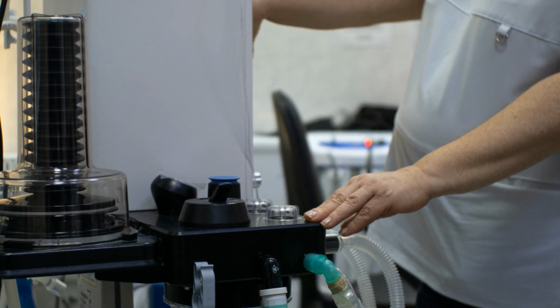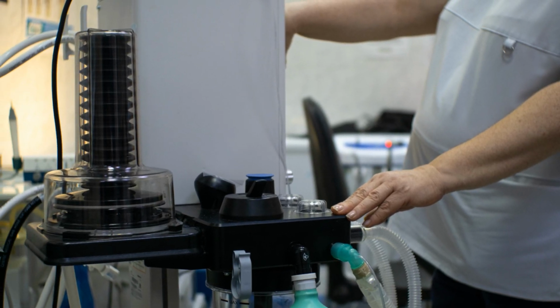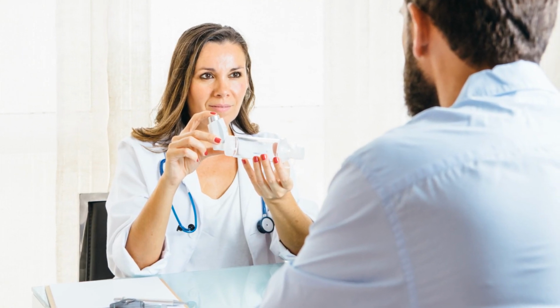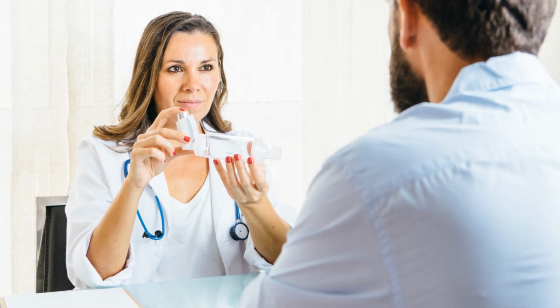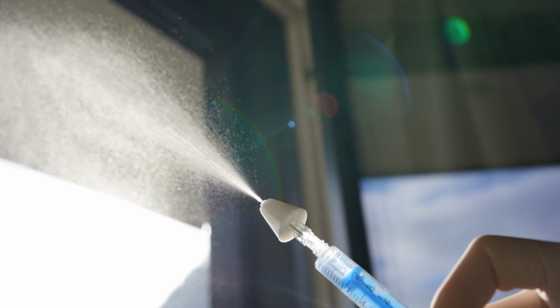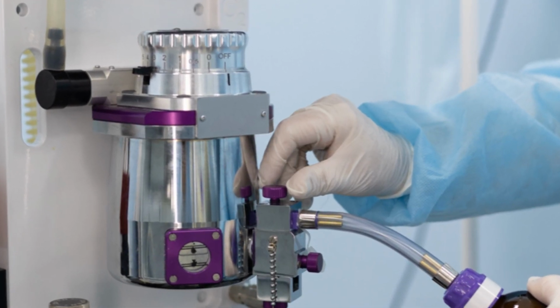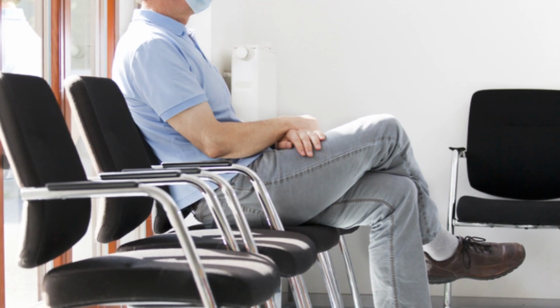The application process itself needs to be thorough. It's not just a quick spray and go. The aim is to get the anesthetic to the mucosal surfaces of the airway. This means applying it to the back of the throat, the tongue, the larynx, and the trachea. Remember, patience is key. The anesthetic needs time to take effect. This isn't a process to rush.